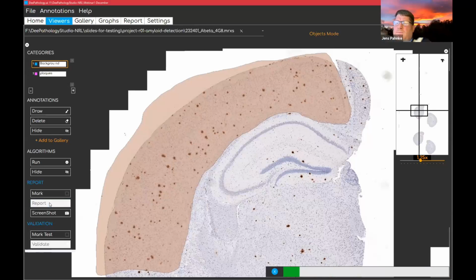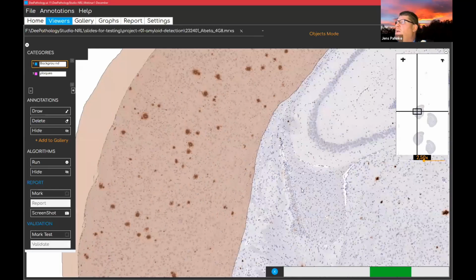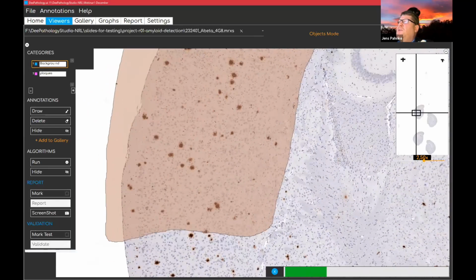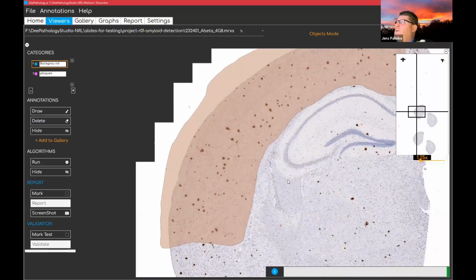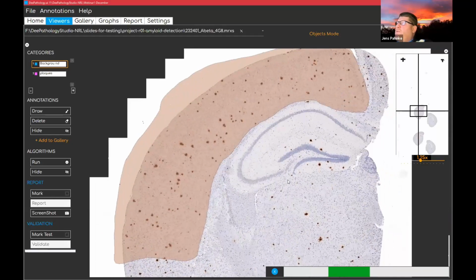It starts to detect, and it starts line-wise going up and down. You will see the results in between already. So I can zoom in a little bit so that you can see how it works from one side to the other and detects this. We also have a batch mode.